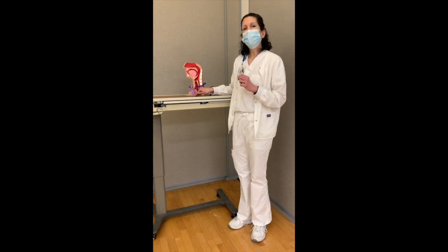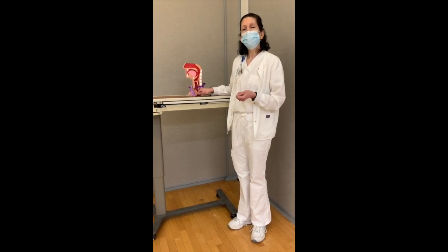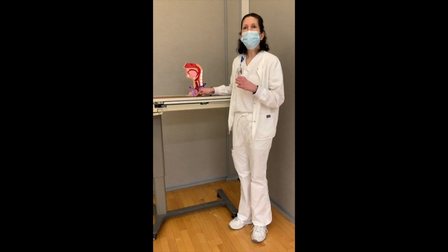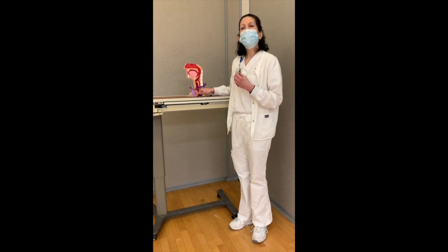Throughout the day, for routine suctioning and trach care, nursing can remove the valve to provide care and then replace it immediately after, because you are confident that the cuff is still deflated and it's safe for the patient to wear the speaking valve.